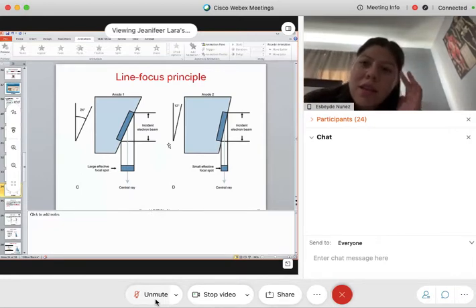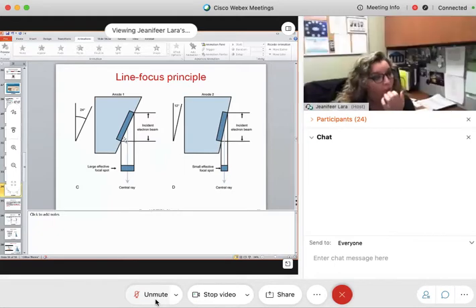Yeah, the 1% of X-rays, hopefully we can capture all of that 1%, will start to flow in the effective focal spot. Okay. So all of the electrons that bombarded the target and were converted, when their energy was converted to X-rays, the X-rays will flow in the effective focal spot.